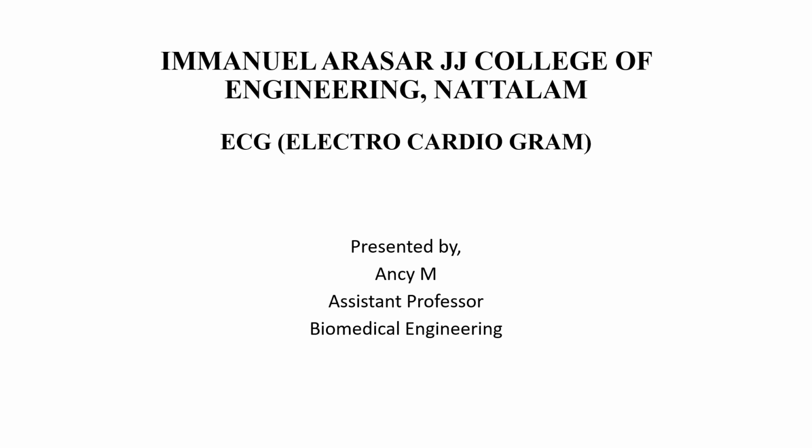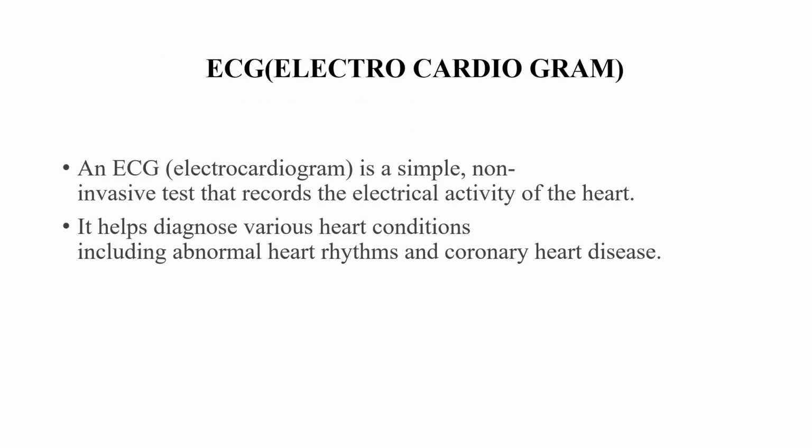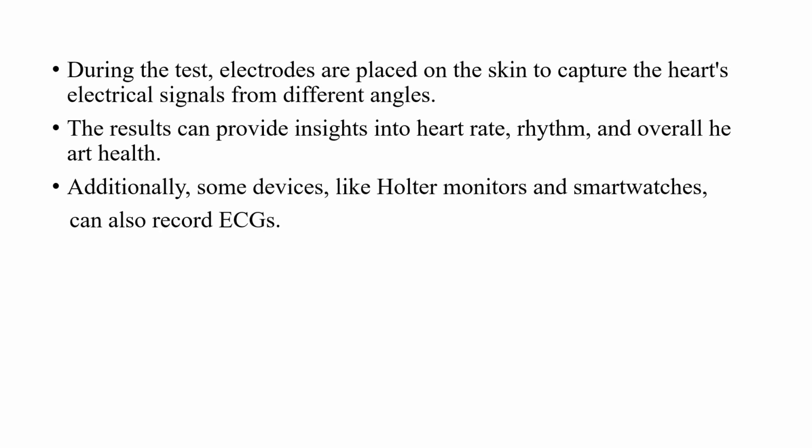Now I am teaching about ECG. ECG, what is ECG? ECG is an electrocardiogram. ECG is a device used to record the electrical activity of the heart. The ECG is a simple and non-invasive test. It helps diagnose various heart conditions including abnormal heart rhythm and coronary heart disease.